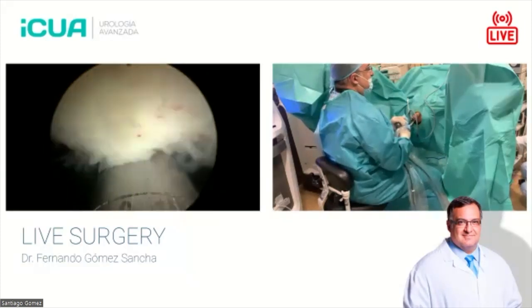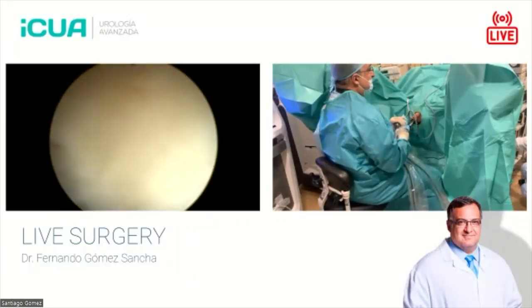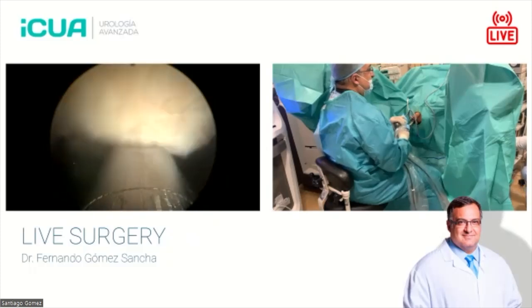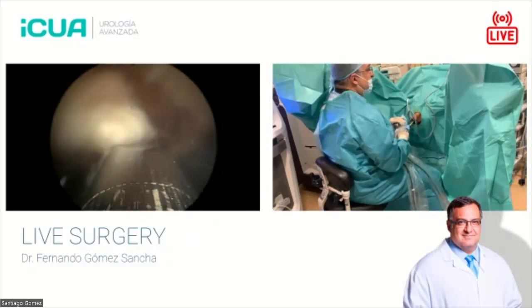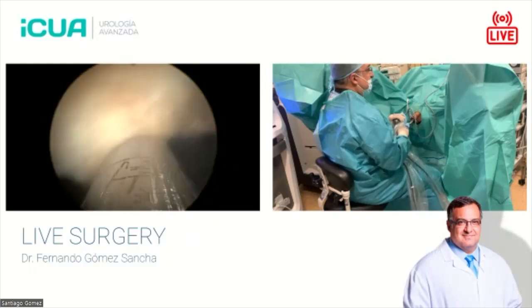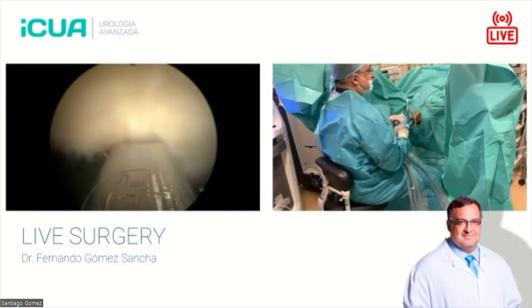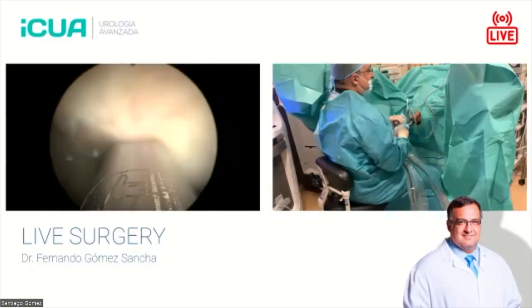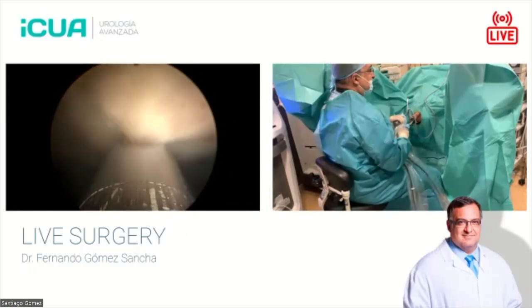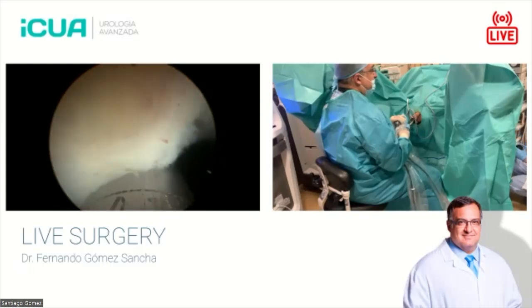Of course, you want to have good visibility. Another piece of advice is don't work like this, you see. If you work with the blade too close to the lens, you will not have any perspective of where you are. If you take the morcellator a little bit more inside, you can see that the upper half of the screen is occupied by tissue. The lower half is occupied by the blade, but on both sides of the blade, you can see two black triangles. And these triangles are showing you that the blade is far away from the bladder because they are black.